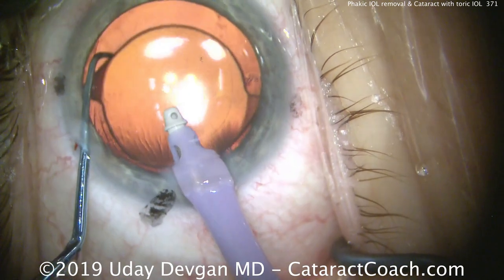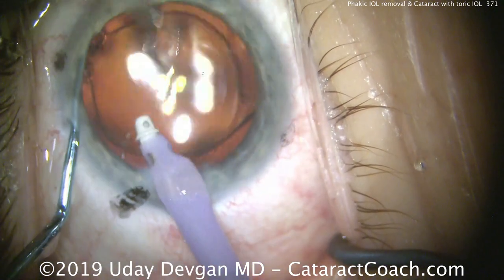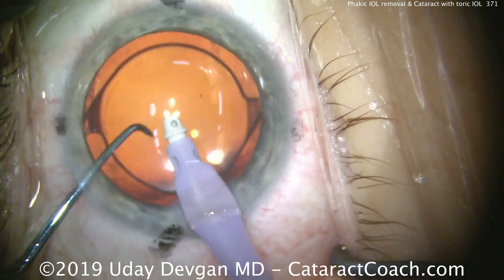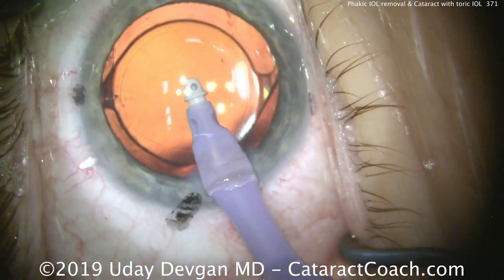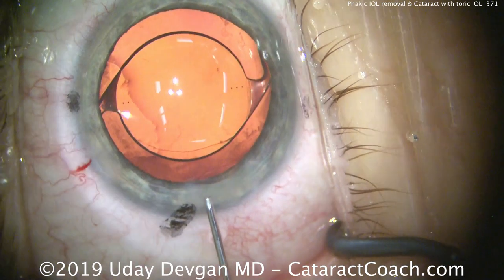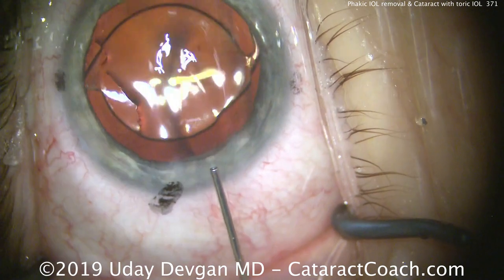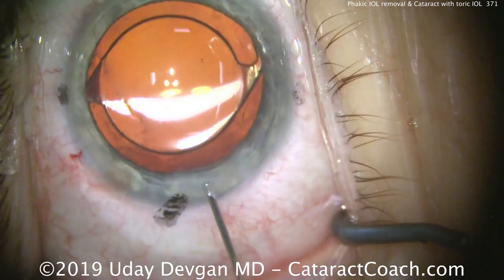We'll seal up the incisions at the end. While sealing the incisions, we can use Balanced Salt Solution on a blunt 27-gauge cannula to further adjust the lens position — just tweaking it to get it exactly spot on. This patient actually saw better than 20/20 the very next morning, so our calculations, surgery, and lens positioning were spot on accurate. We'll seal up the incisions with Balanced Salt Solution, going back and forth to seal nicely. Don't do excessive hydration, as that'll change the shape of the cornea and induce temporary astigmatism — just enough hydration to seal the incision.